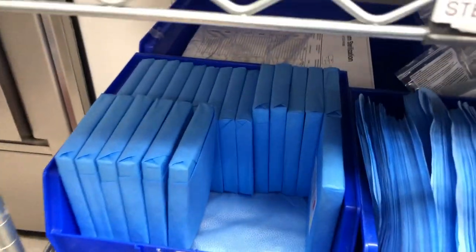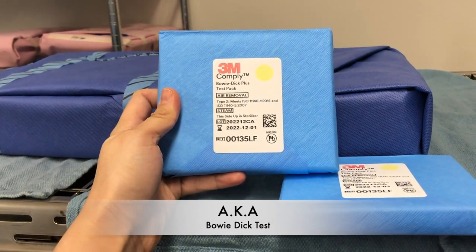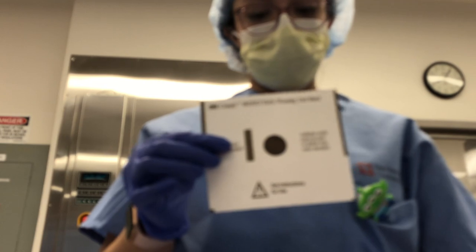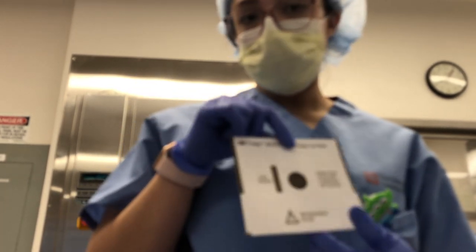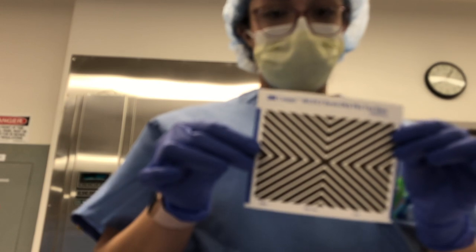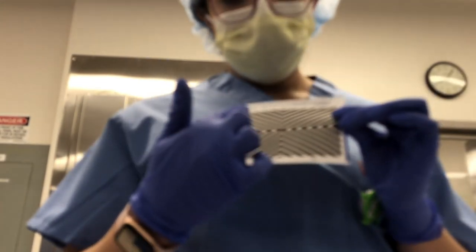First things first, we're going to head over and get some Bowie-Dick tests. These are the tests we put in the sterilizers first thing in the morning to make sure they're working properly. The test has two pages — both the bar and the circle should be black. It also asks for your initials, sterilizer number, and load number. If either page comes out brown, you should redo the test or get a sterilizer check.